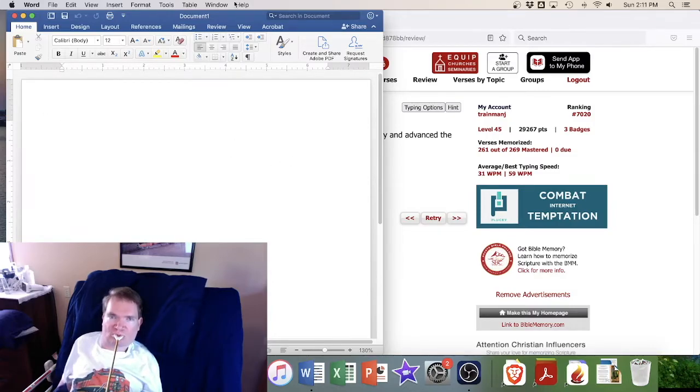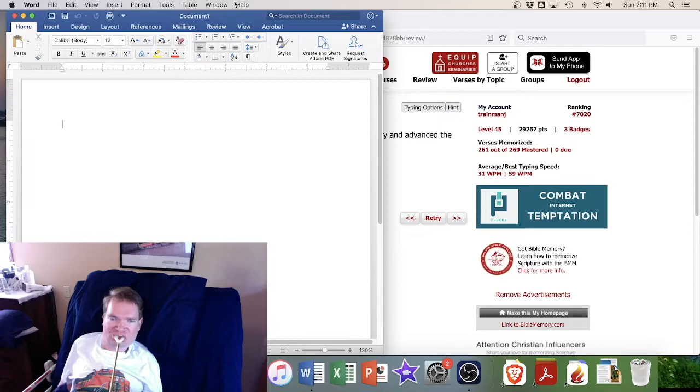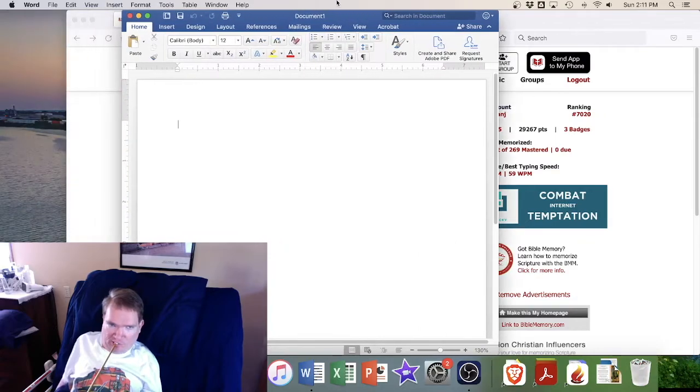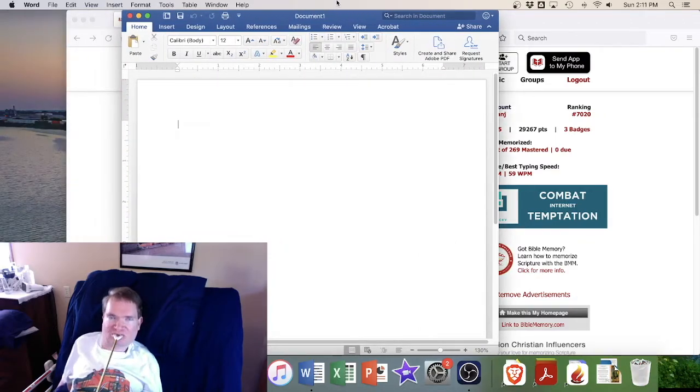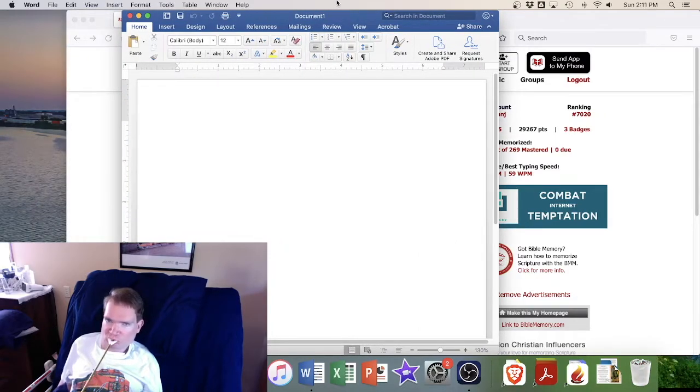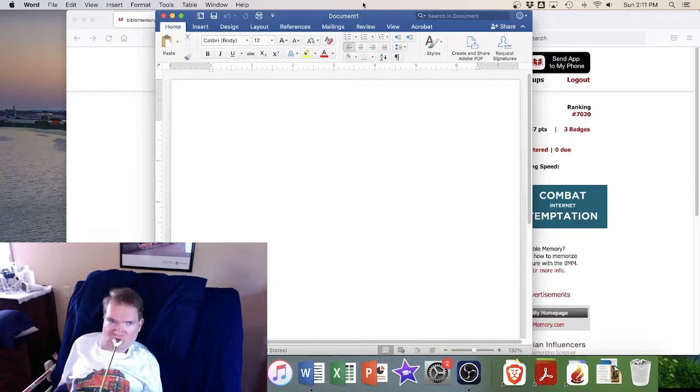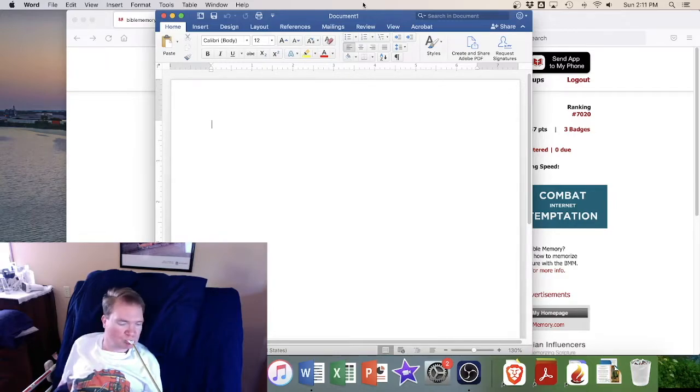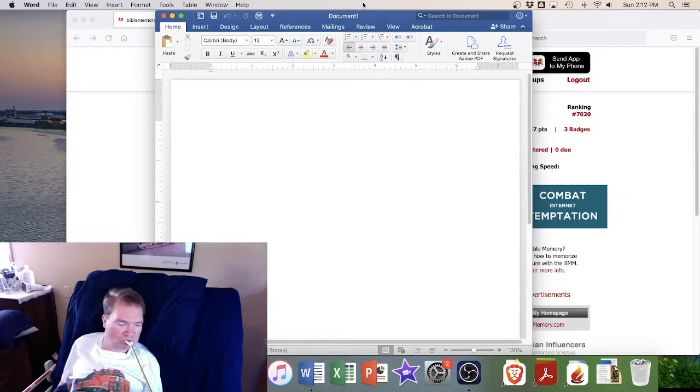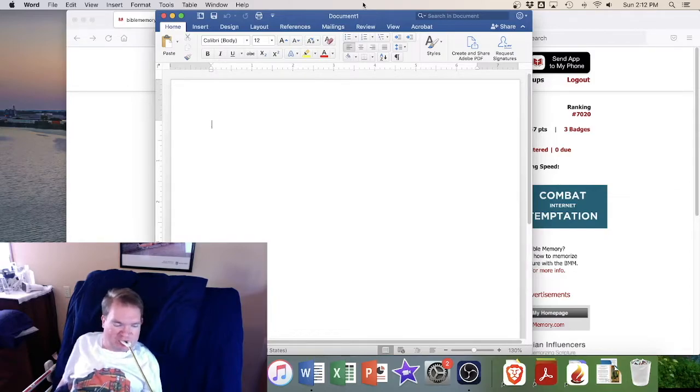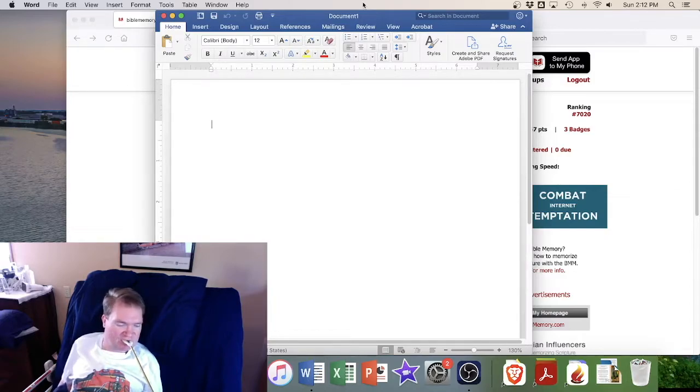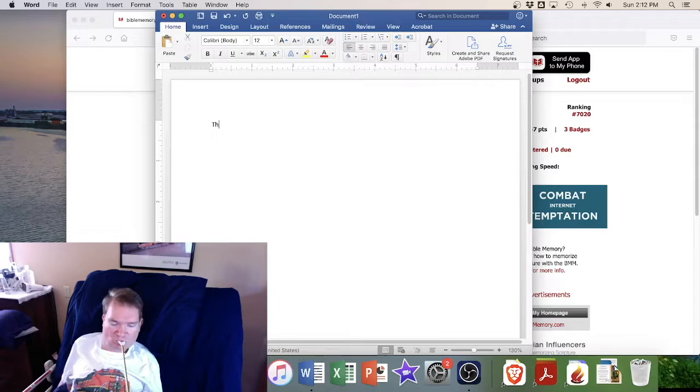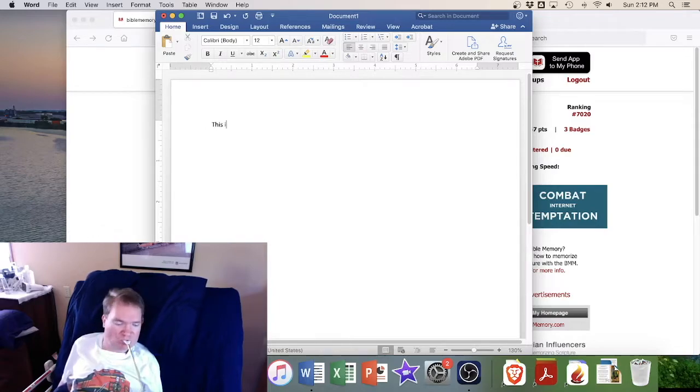So someone might ask how you do things like say capital letters. Well, with this document here, this plain Microsoft Word document, there are different options you can do. Like you can do caps lock, turn it on, do a capital letter and turn it off, and then keep going.